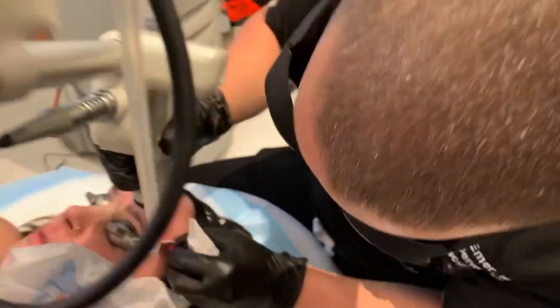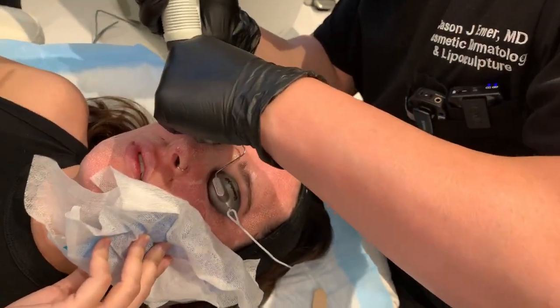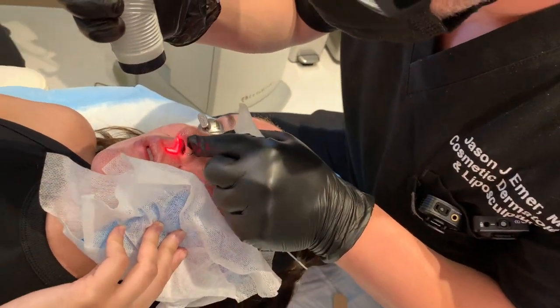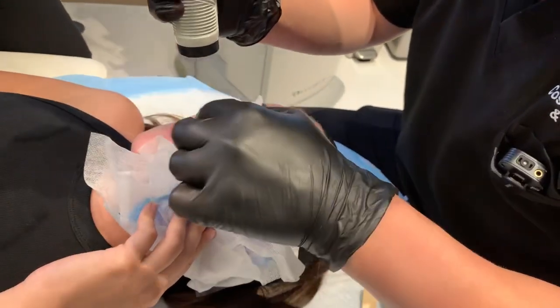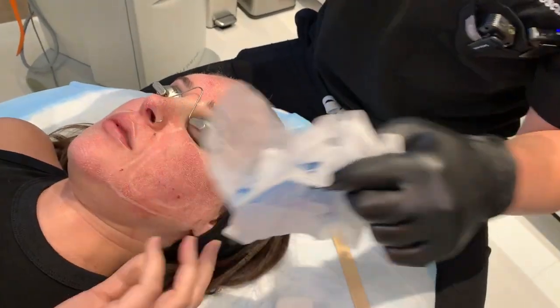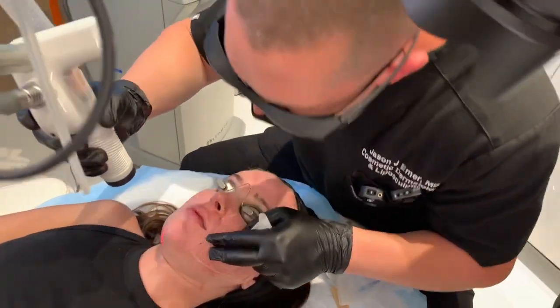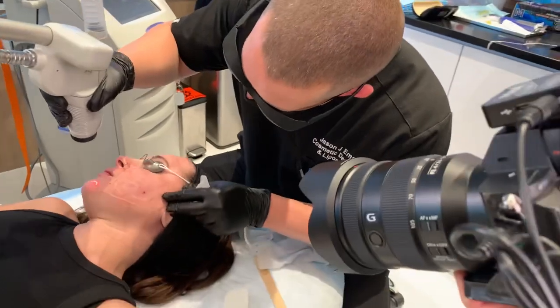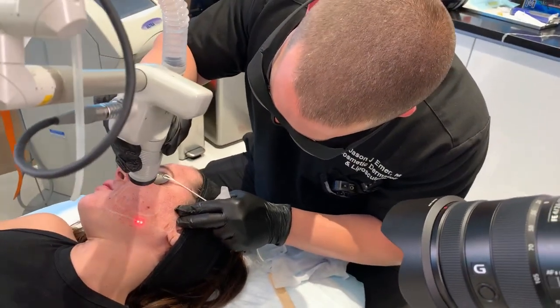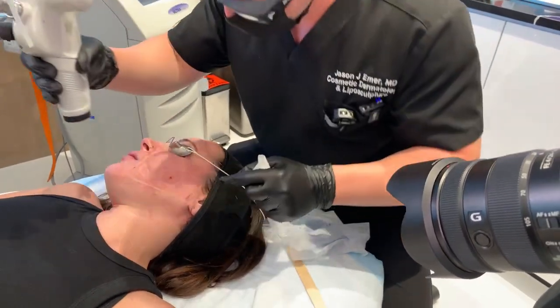Okay. Blend everything. Perfect. And that's really it, you guys. Perfect. Now I'm going to take a quick look. I'm going to take everything down. I'm making sure the edges are blended completely. And have it right a little bit. I'll blend the edges here. And then we're going to put our healing protocol on. Perfect.